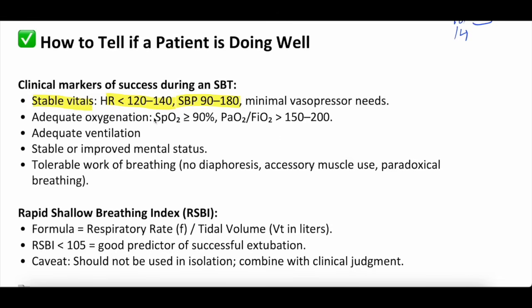Can they still oxygenate, right? Are they maintaining their SpO2 above 90? If you send a gas, a P to F ratio greater than 200. But really the message here is, are they still able to oxygenate while on a pressure support trial on the vent? Because if they're getting hypoxemic, that might indicate they're not ready to be liberated from the ventilator. Same thing with ventilation. Are they still able to ventilate adequately? They're not getting more hypercapnic.